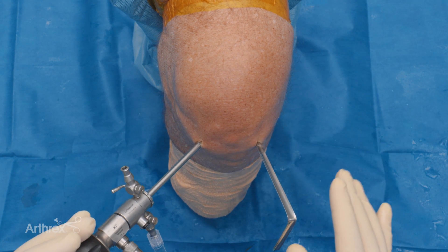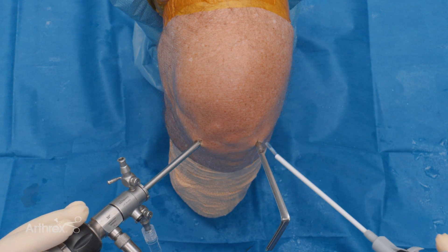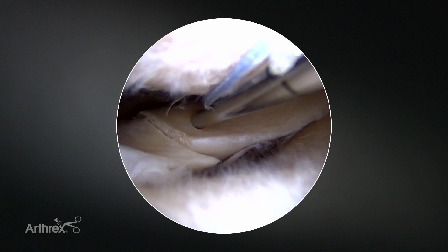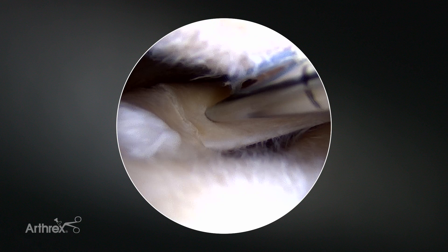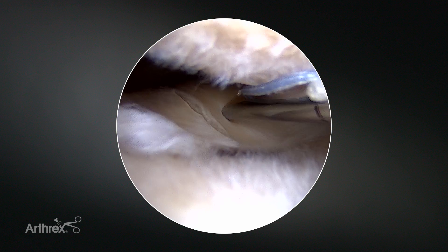So with this, we're going to start with the 12 degree up. You can see from the outside we have a little skid to help get in the joint. To start this repair, you can choose either side, and we want to transversely bring this tear together, sort of get up as high as we can.